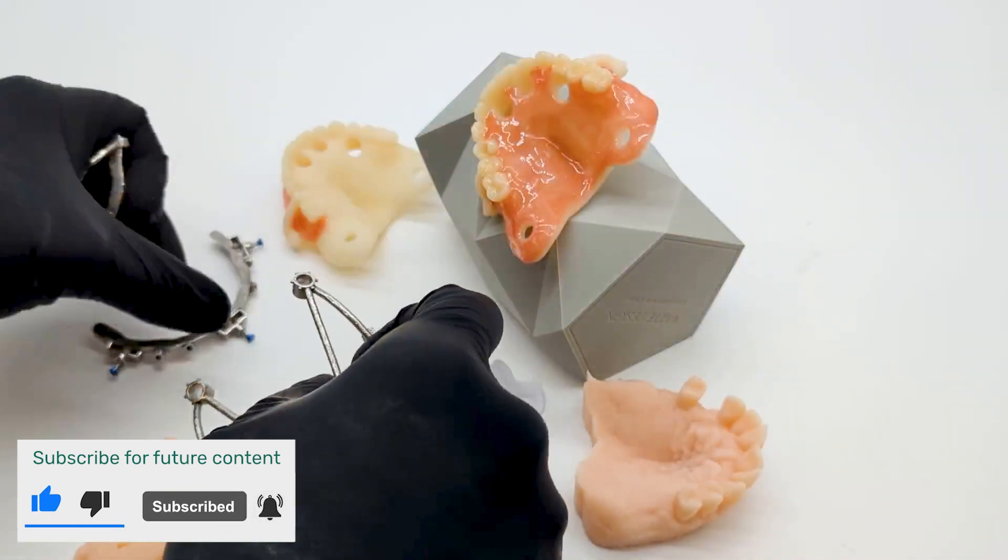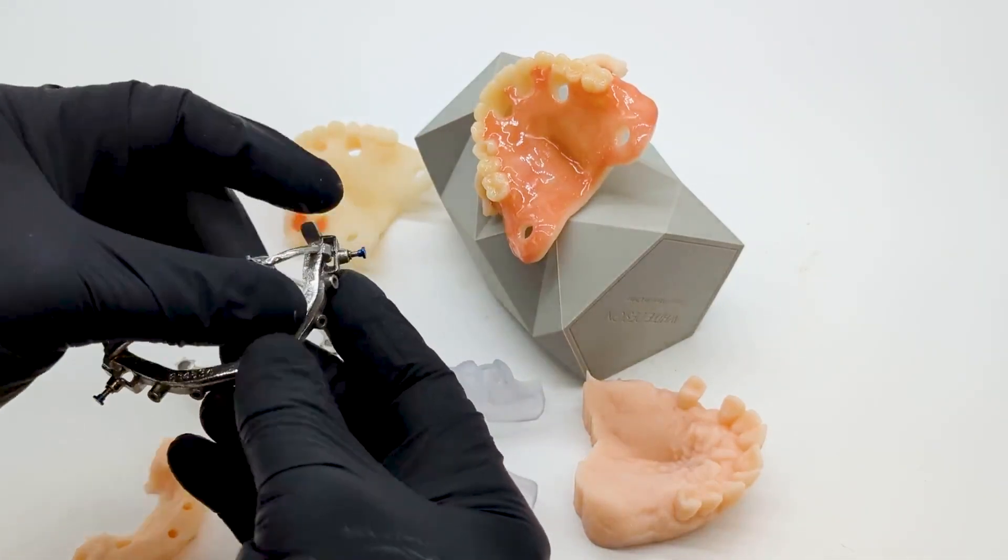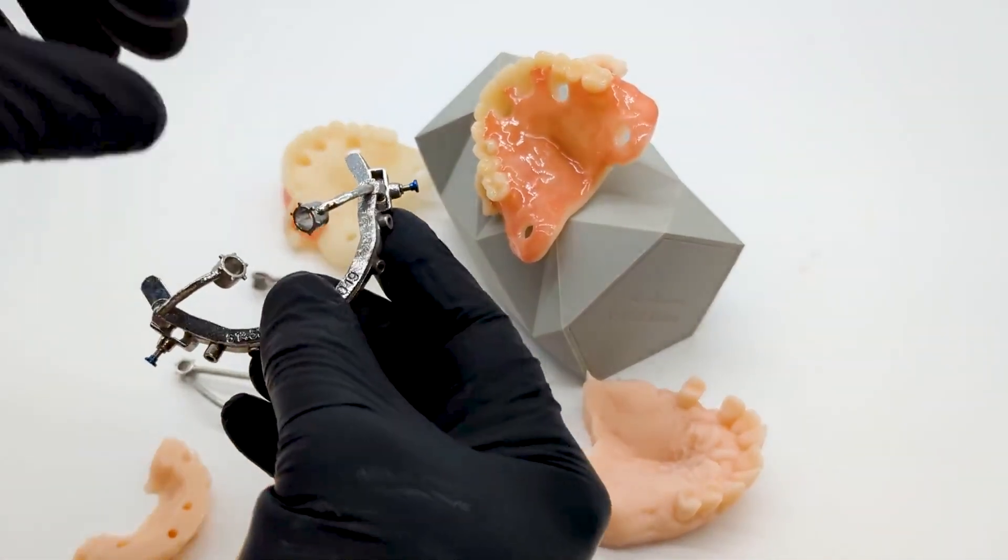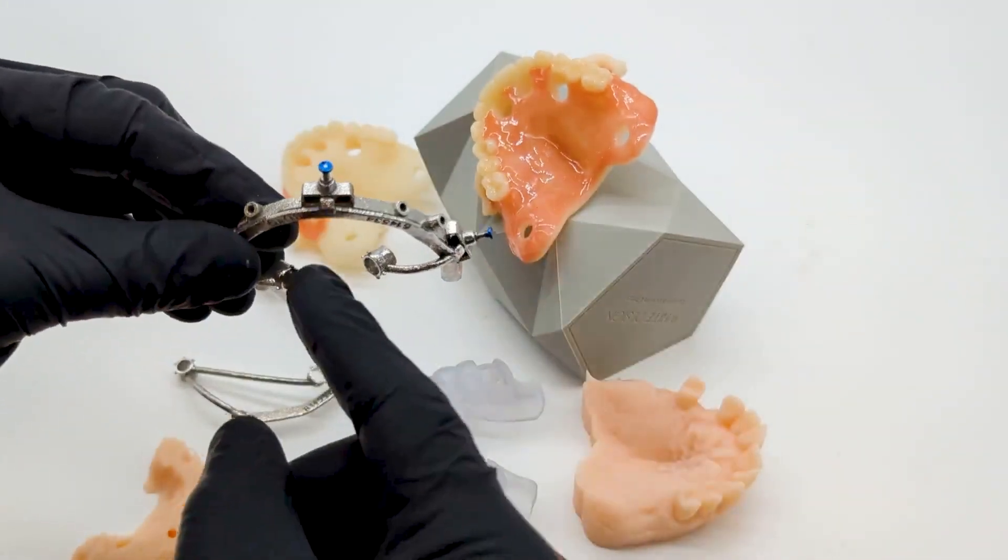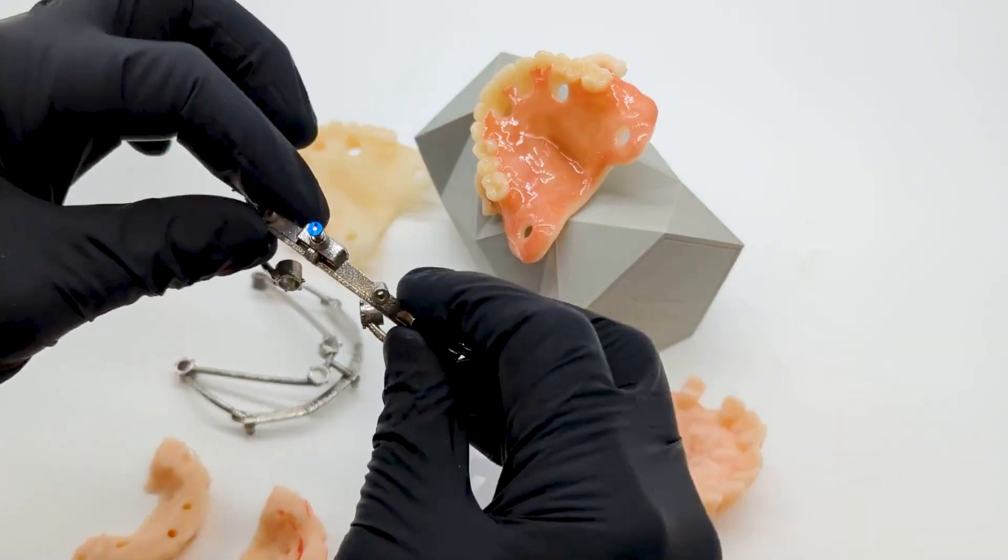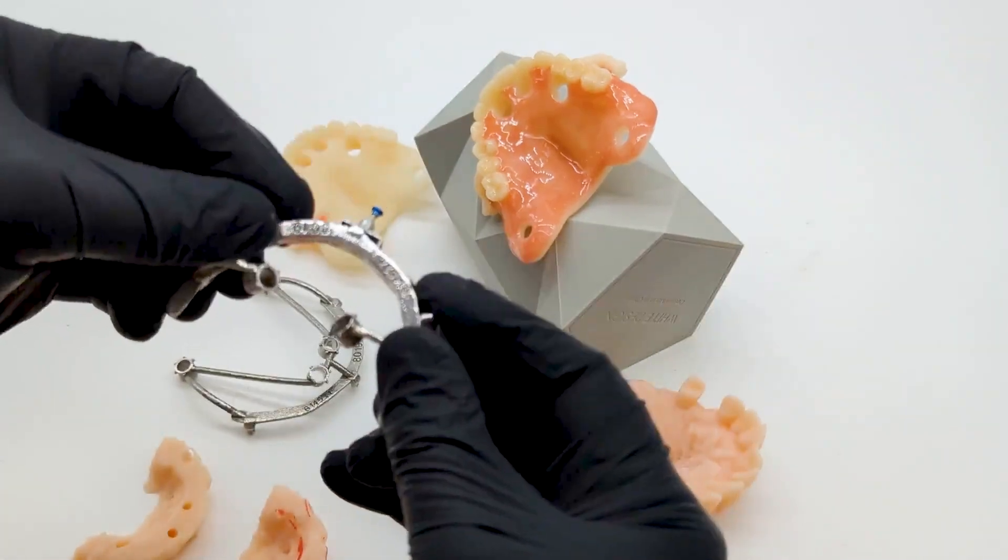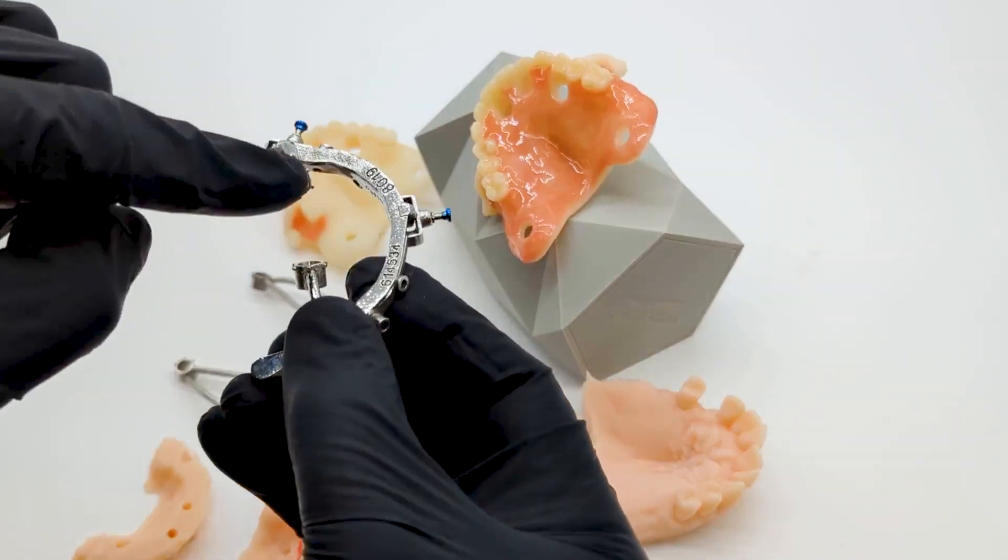Here is a fun Chrome Guided Smile case. This one's got a lot going on. This is going to be a zygo case. We're going to control the exit point for the holes in the prosthesis, and that's nice and fixed on the metal fixation base osteotomy guides.